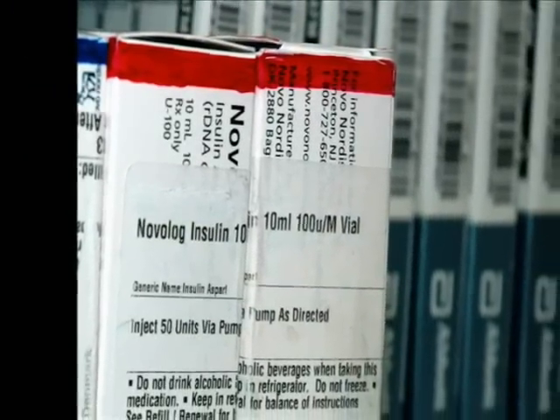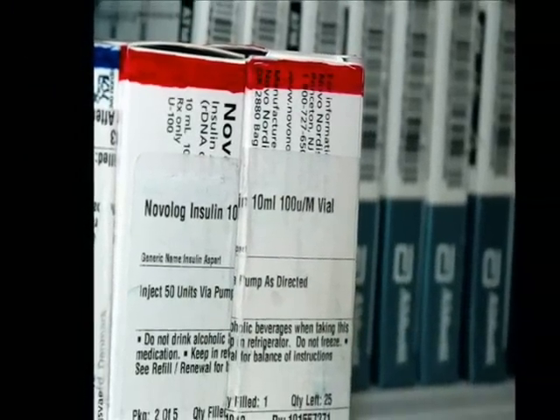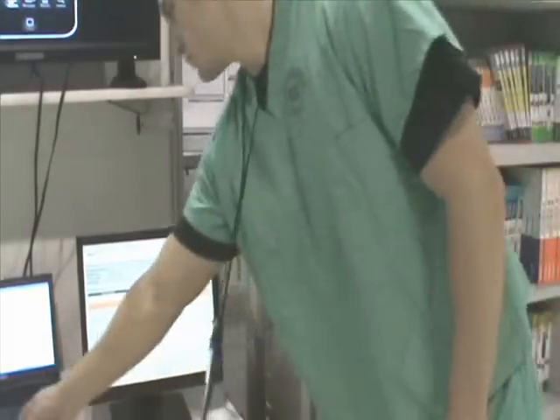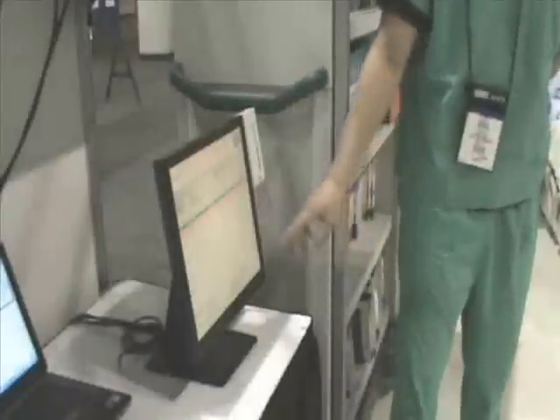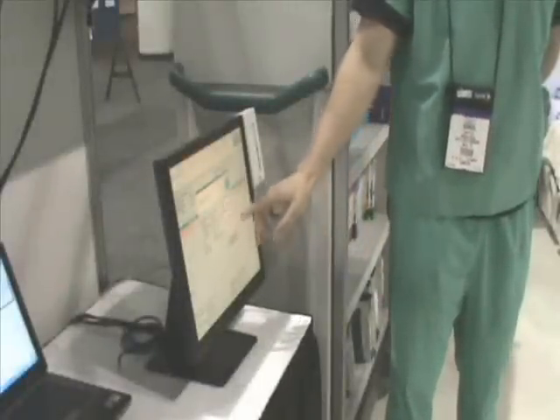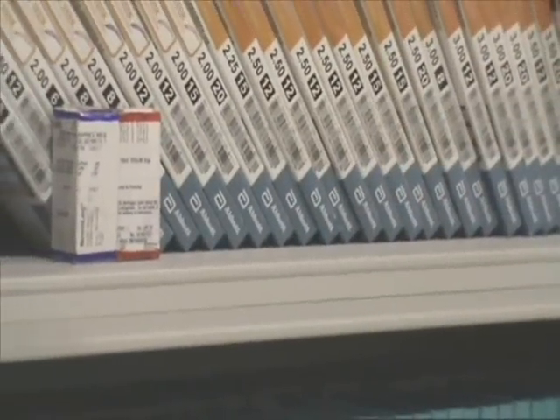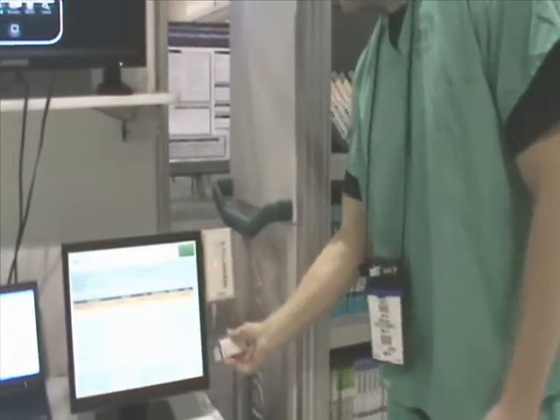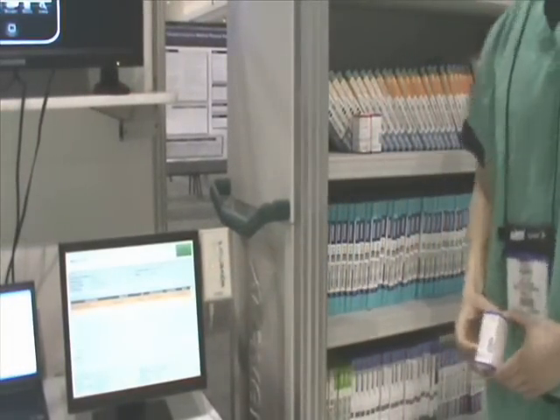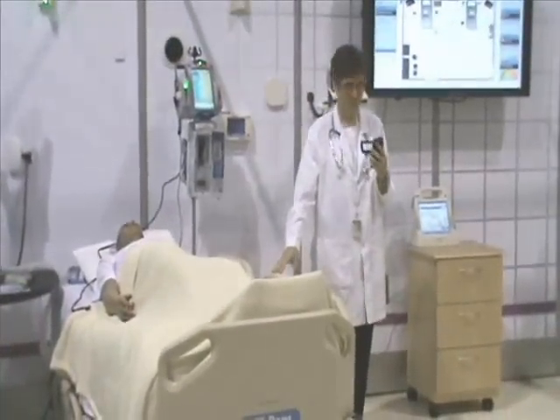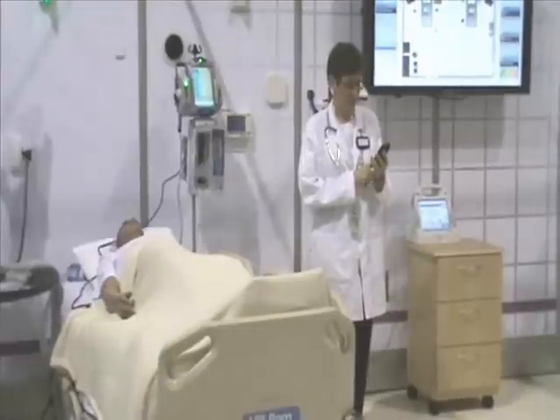Fundamental to the process is the verification and status of the items, including lot number, serial number, and expiration date. This product is expired, so we are provided a real-time alert to ensure that an expired or recalled product would not be used on the patient. We will try this again with a different bottle. The process is repeated and product validation is received. This RFID-based tracking and validation decreases the possibility that expired and recalled products are used on the patient, and ensures the patient record is appropriately updated.